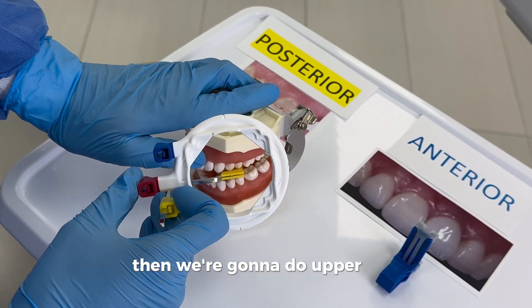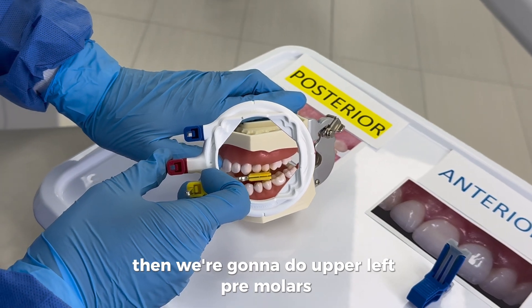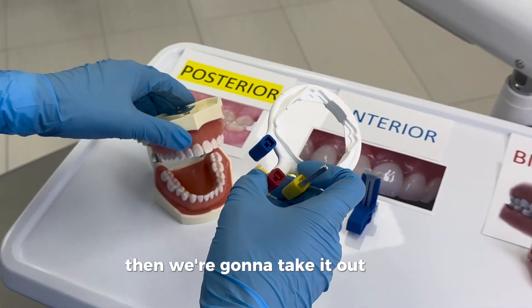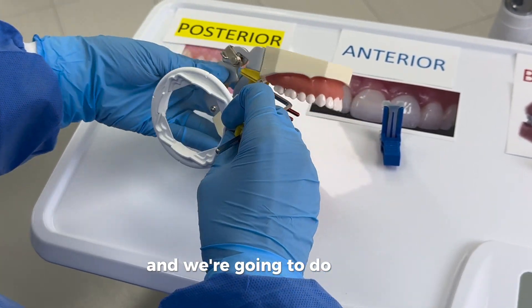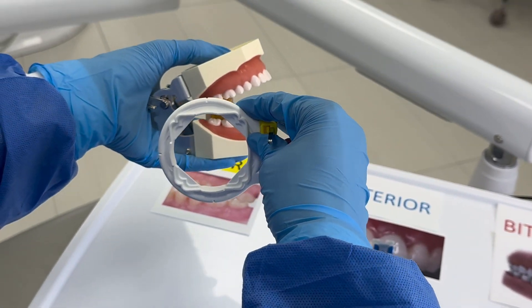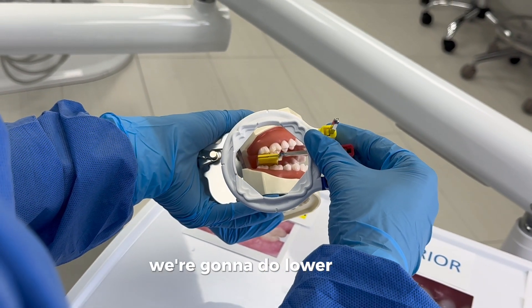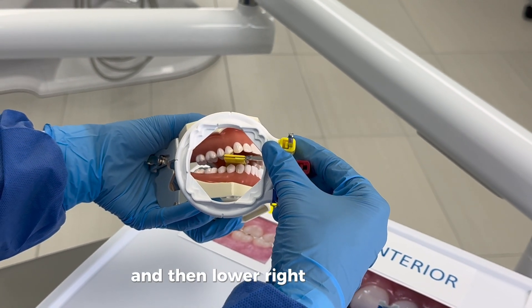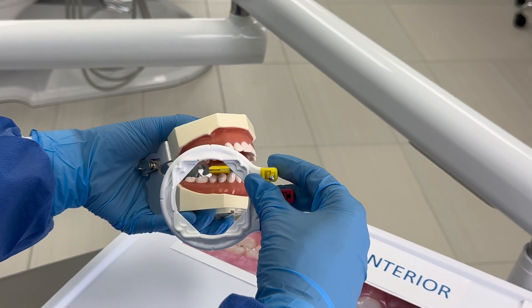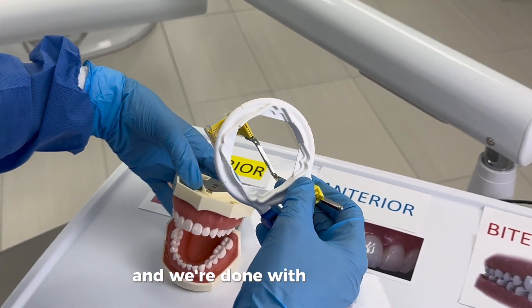Then we do upper left premolars. We take it out, flip it, and do lower right molars, then lower right premolars. And we're done with the yellow.